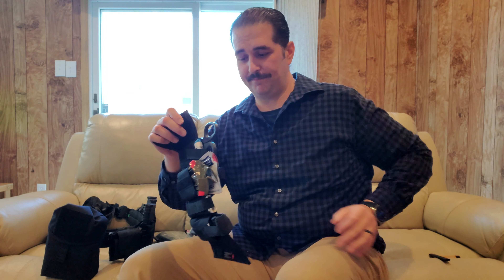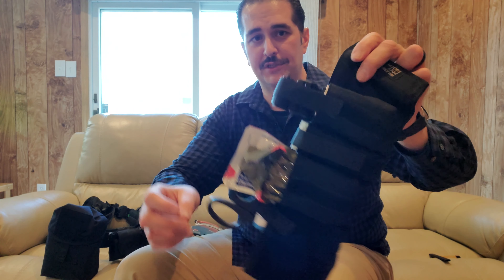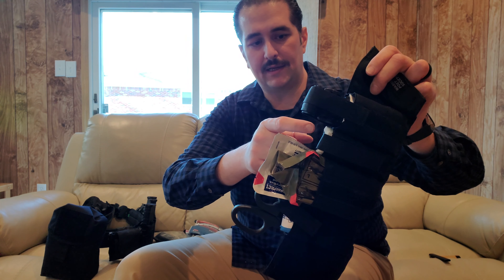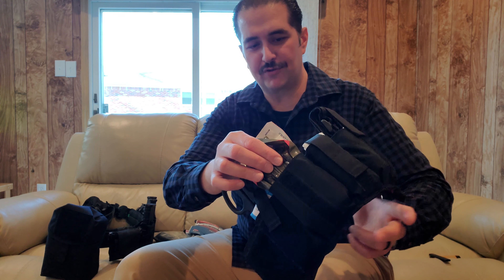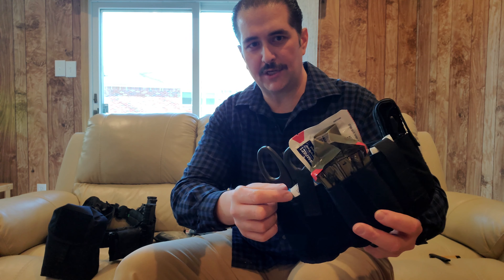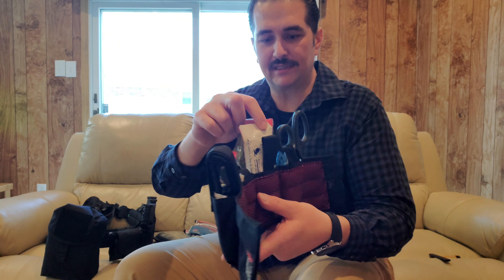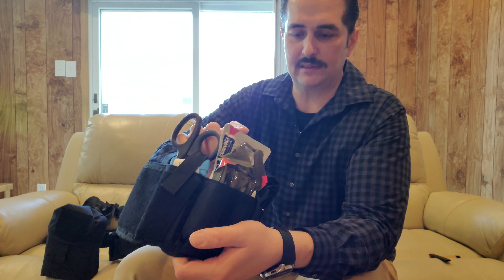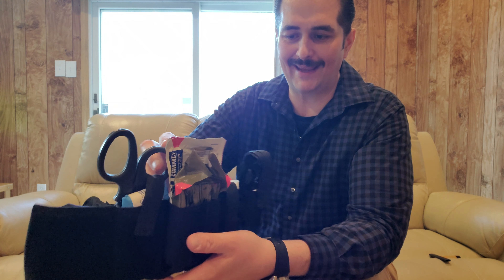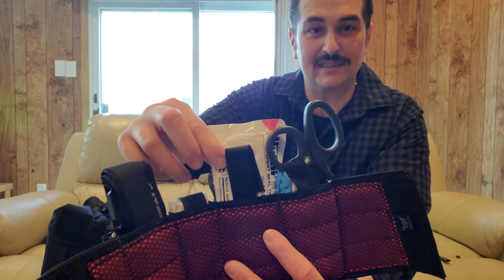I also carry this — I strap it onto my ankle every morning. I put the iron on my hip, I put the IFAK on my ankle. It's a Warrior Poet Society ankle IFAK. It comes with a Generation 7 CAT tourniquet, a nasal pharyngeal airway, a four-inch emergency trauma dressing, nitrile gloves, and North American Rescue trauma shears.